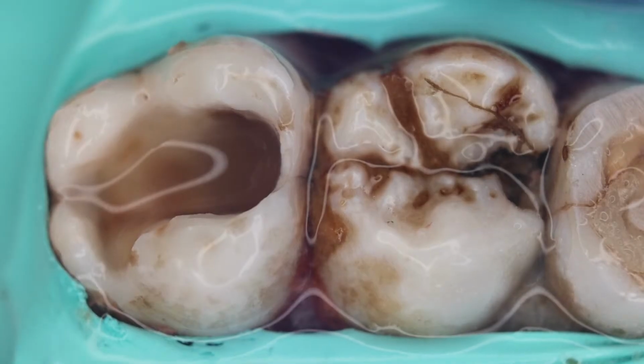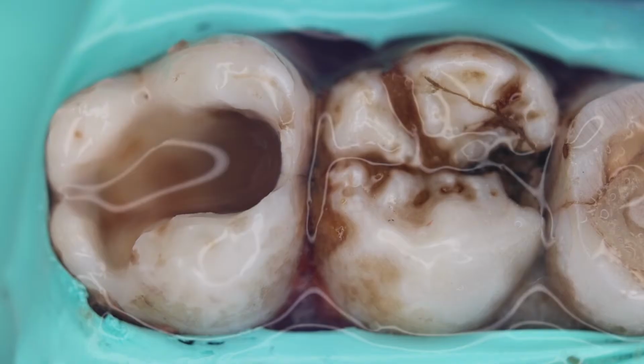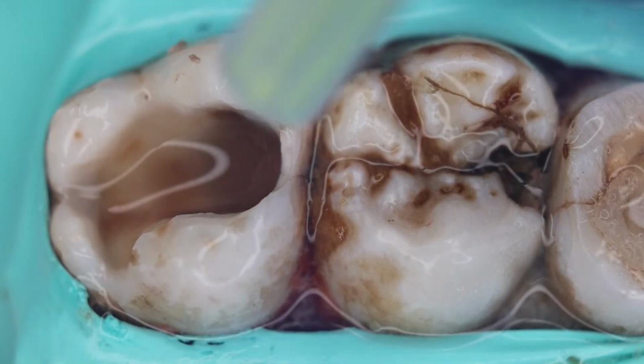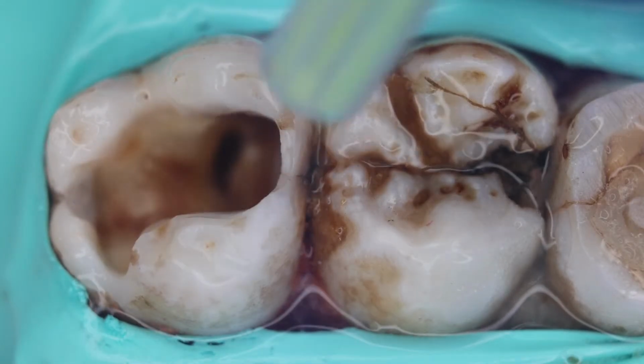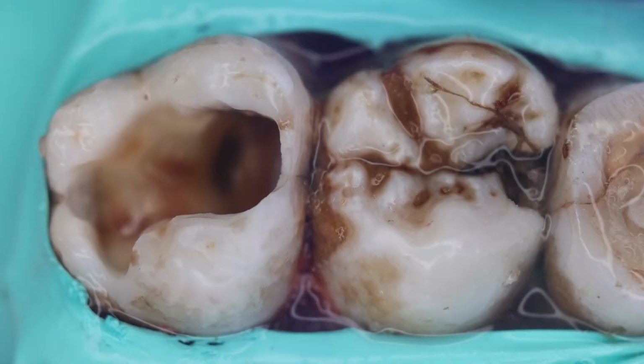So this was all about the cavity preparation. Hope the steps were clear to you. Hope you were able to understand the idea of the cavity preparation.